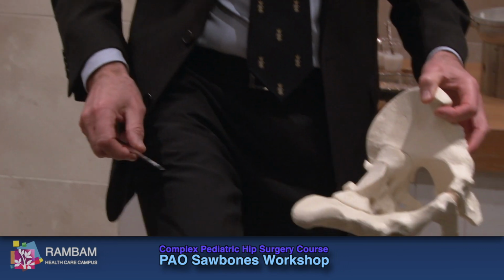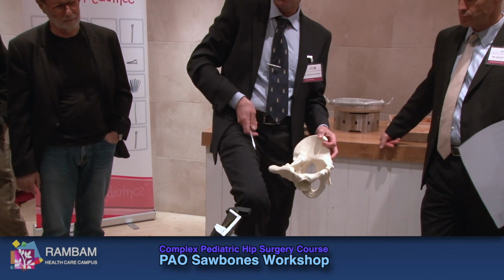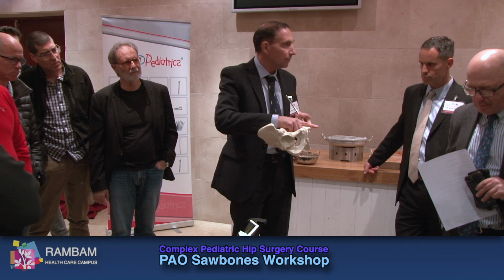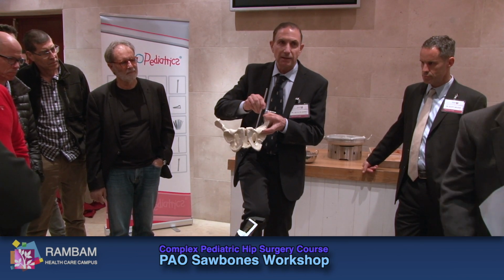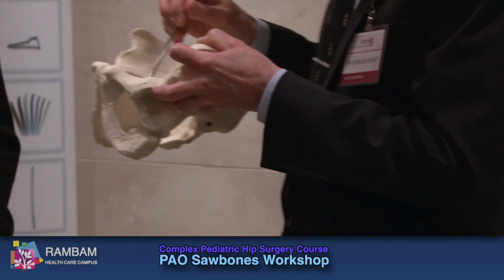So you put the leg up in a slightly flexed position like this, you slightly adduct the leg like this to release, so you don't have too much traction on the femoral nerve and artery when you're using this retractor. This is underneath iliopsoas. The femoral vessels are coming across on the top here, like that. So you're lifting them up. So you lift the leg up like this, adduct it so that it's nice and loose, all right? And then you put your retractors around here, subperiosteal, and do your pubic osteotomy.